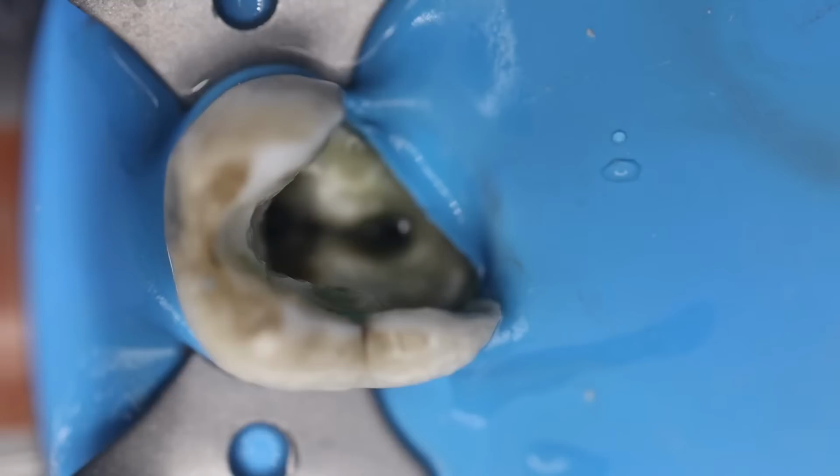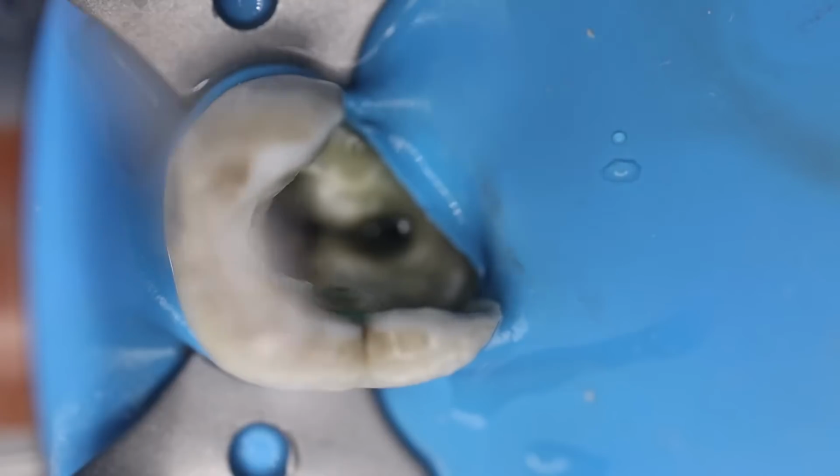In these situations, we can proceed easily by first removing the restorations or the dislodged restoration, removing the caries and the weakened tooth structure, and then we get the access. Isolation with the rubber dam is a must. We will be back with an ideal tooth and a special case for the access opening, and then we can proceed with the biomechanical preparation.